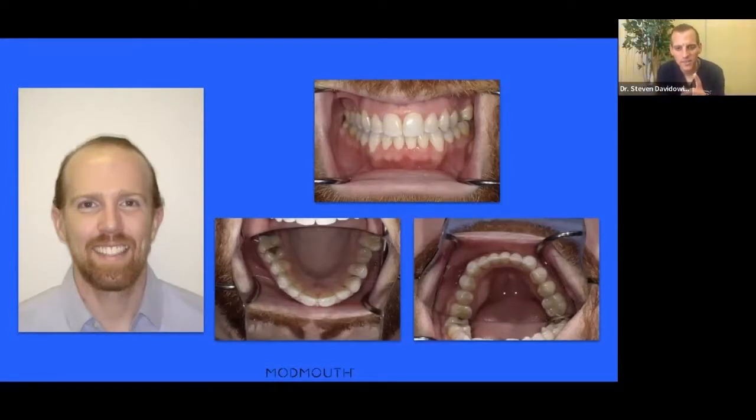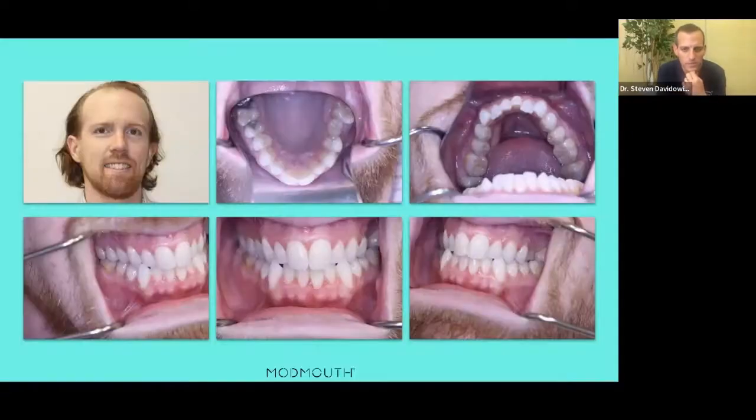Look at the retracted view of the lower anteriors, and look at the gingival levels there. And if you go back, Chris, to the previous intraoral photos, this is what the hygienist was pointing out. Look at the edema, the redness, right? And look at 24. 24 started a recessive pattern. The gingiva was so thin, he was going to end up with a nice amount of recession on that tooth.